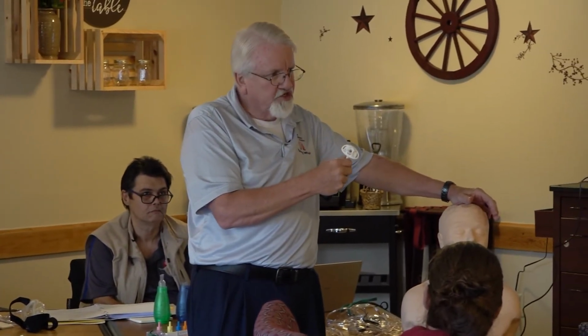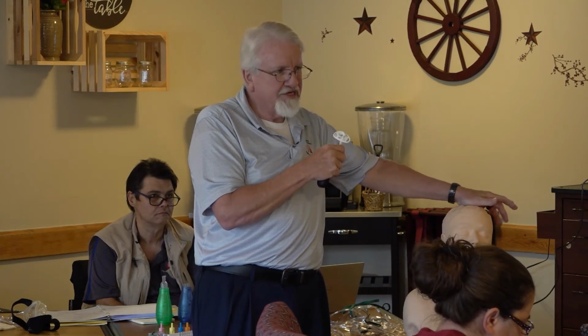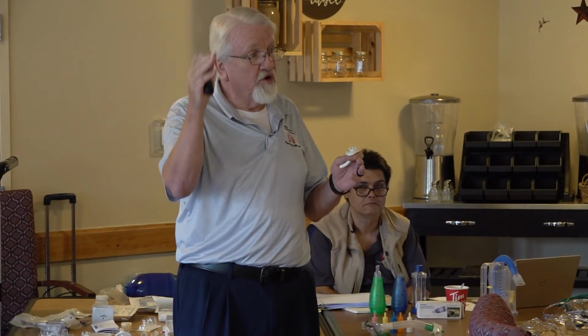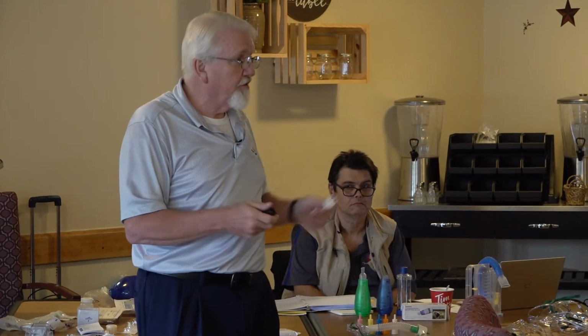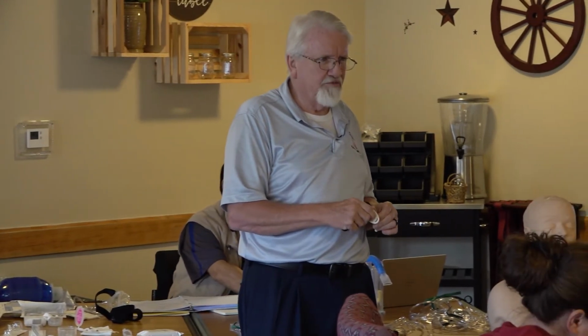And after, those will come out the initial change. It will vary from 7 to 10 days. Pretty much 21 was the max. We would never leave them in that long. But usually 7 to 10 days is going to be the initial change. I don't know what the rules will be here. Usually the initial change has already been performed before they are sent out to a SNF. That's not always the rule. A couple weeks ago I just had to go do an initial change in a skilled nursing facility. Unusual, but it does happen.